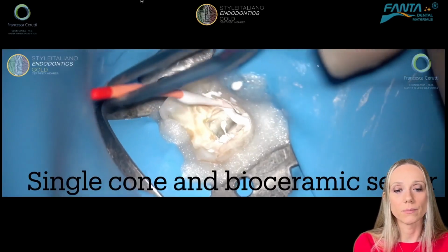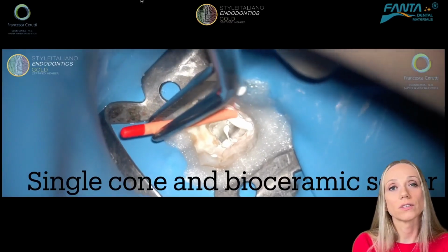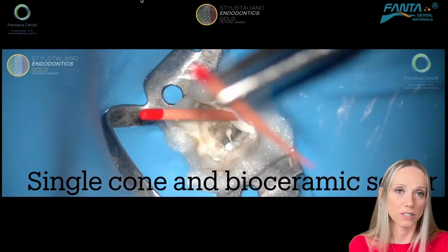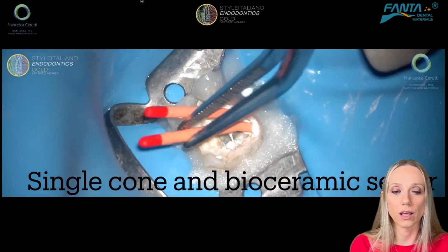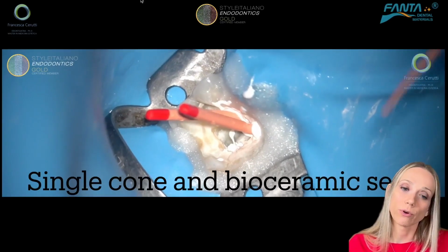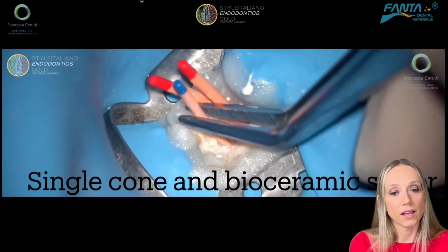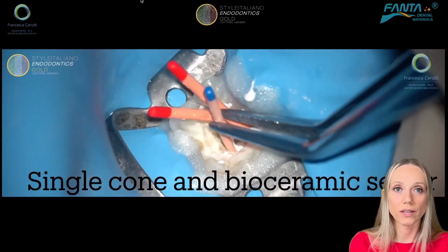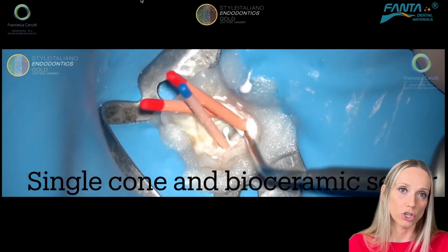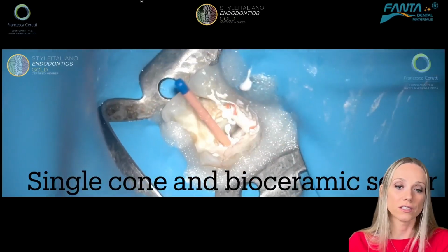And then I take my gutta percha point and you see I check if the tip of my gutta percha point is covered in sealer. That means that I put it correctly into the root canal, and then I arrive with all of the gutta percha points that I need. In extremely large or oval canals, if you want to use this technique, you can choose a master cone and some accessory gutta percha points in order to reduce the amount of sealer inside of the root canal.